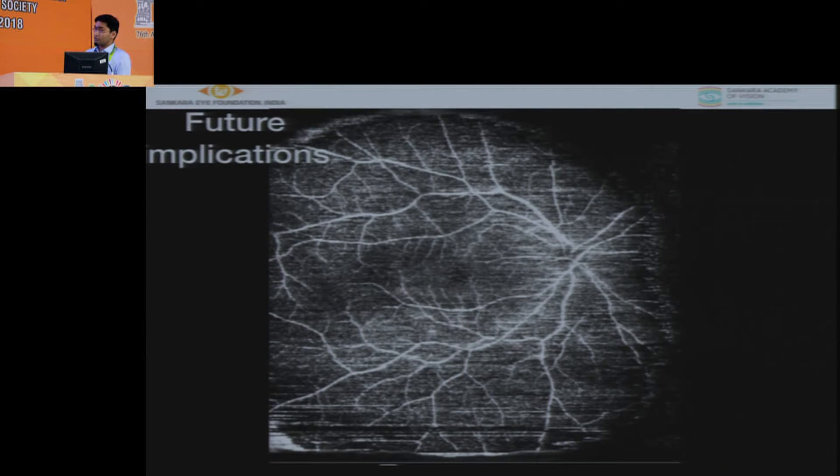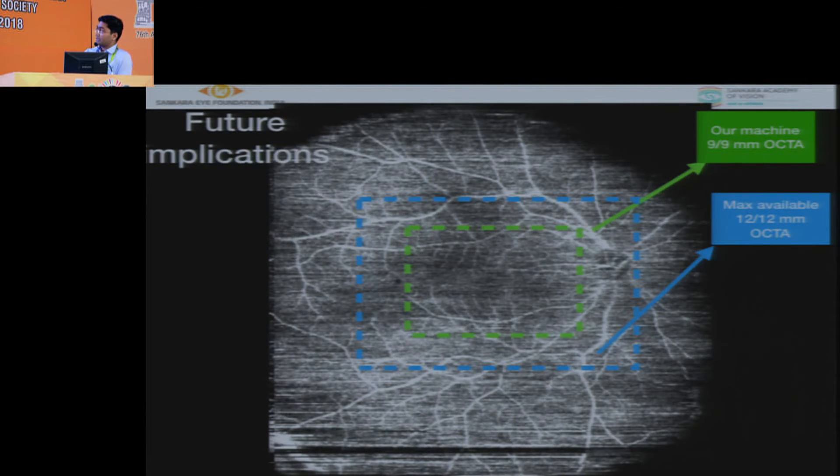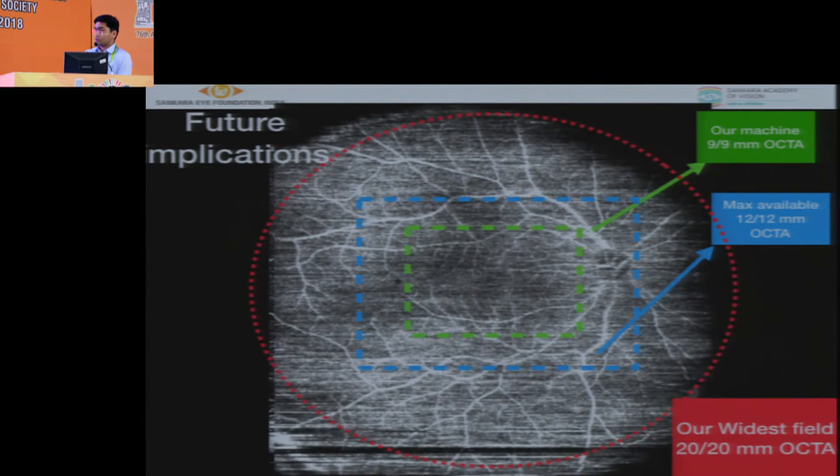Future implications - what you see right now is what we have done, the superficial and the deep retinal OCTA which we have done. This is what we have 9x9 and this 12x12mm which is maximum available right now. We are giving you widest OCTA - 20x20mm.